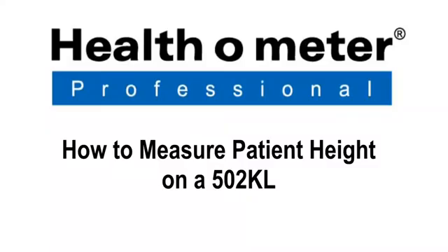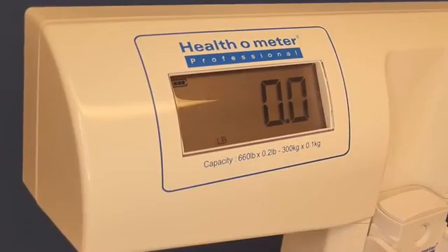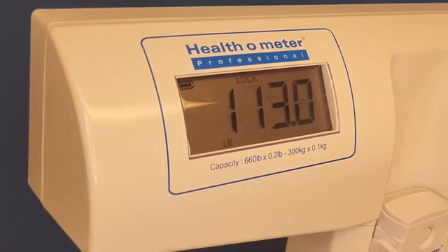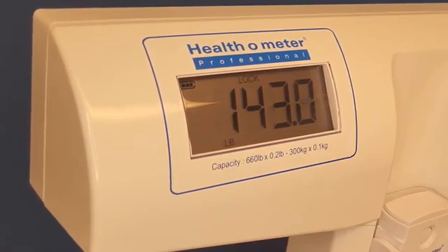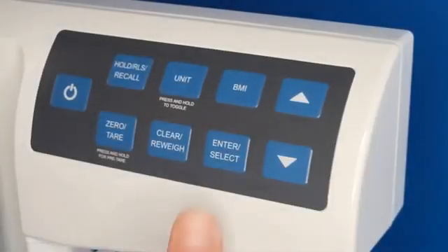How to measure patient height on a 502 KL. Power on the scale, and when the display shows 0, assist the patient onto the platform. Allow the scale to lock on the patient's weight. To enter height mode, press the BMI button.